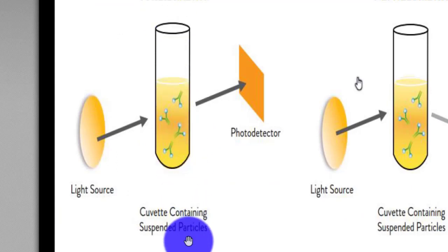Here, turbidimetry: cuvette containing suspended particles, the light source, photodetector. Here, the light source, nephelometry, cuvette containing suspended particles, and the photodetector.